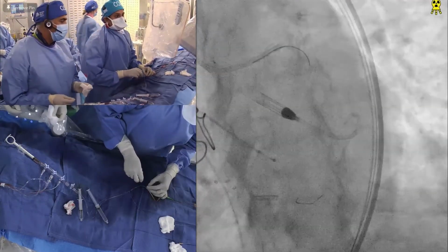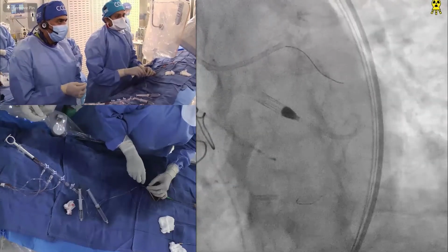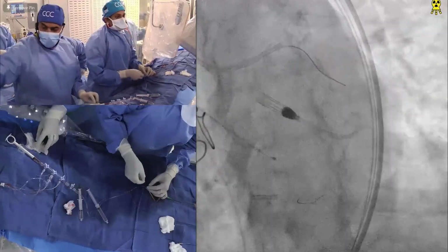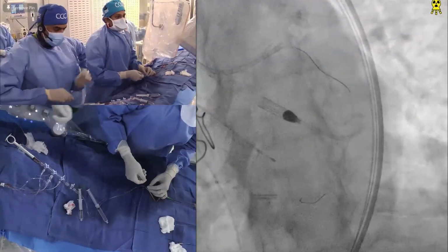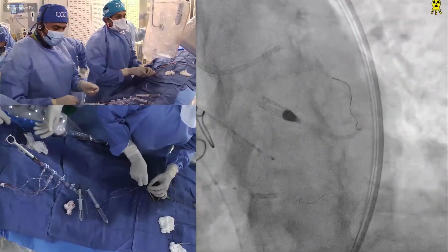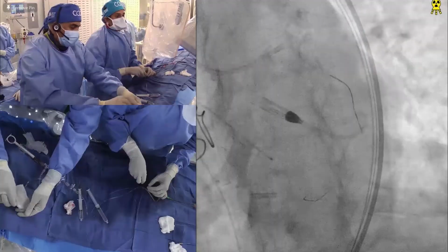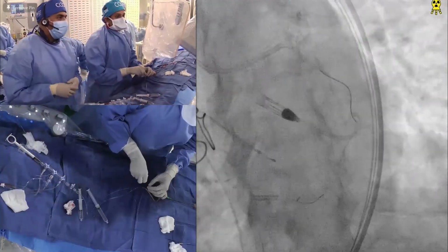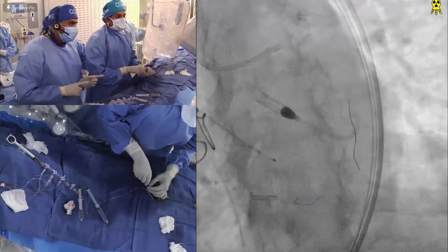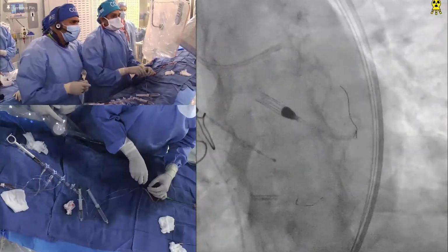Now your stent will expand. So that's the reason. You're right. If we just go by the principle of debulking or plaque modification, this is not the right approach. Now many people are very much against the 1.25 burr. One of the reasons they say is it gets stuck. We probably do the highest number of rotablation in the world, about 60 per month. Our burr, if ever stuck, was never 1.25. It was either 1.5 or above, in an unexpanded stent or otherwise.